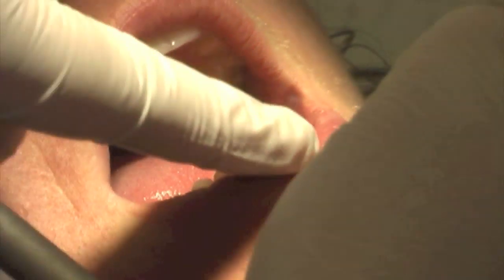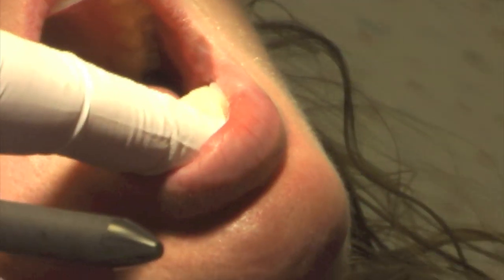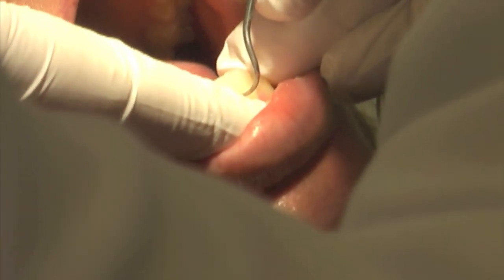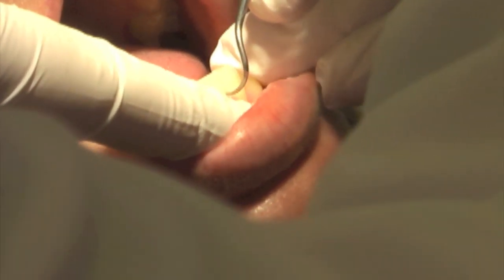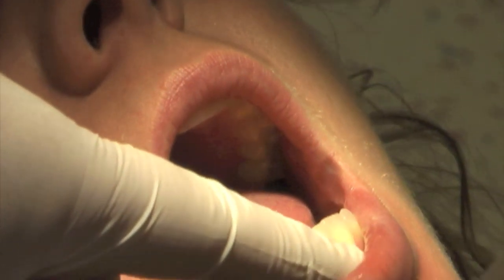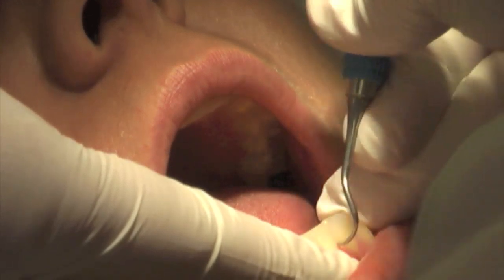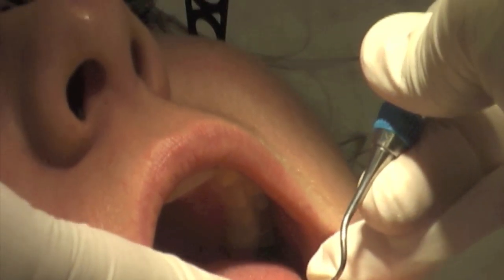If I'm sitting at 8 o'clock to do that other position, that's a difficult thing for me to do because from here I innately want to come in this direction — toward the tooth. So if I'm over here, I'm going to want to pull away from the tooth. Most people forget about going toward the tooth; they pull away and then cut the gingiva, which is more uncomfortable for the patient.